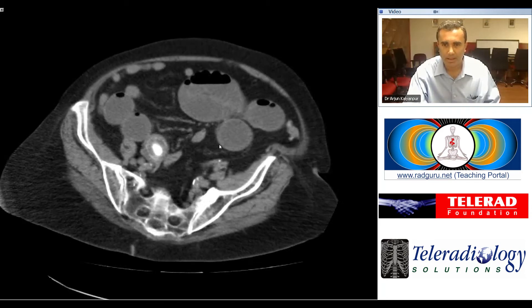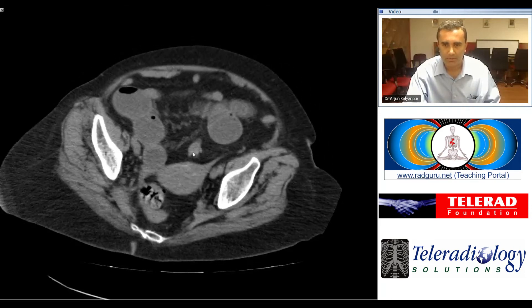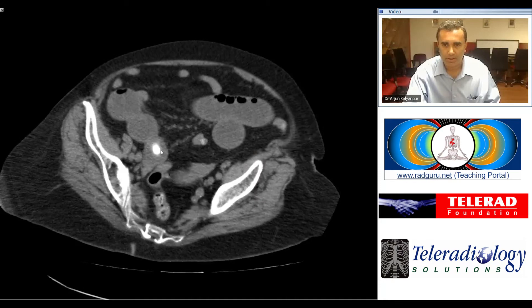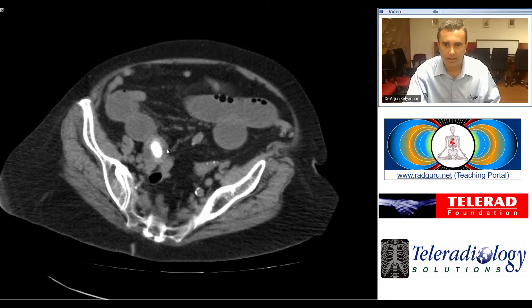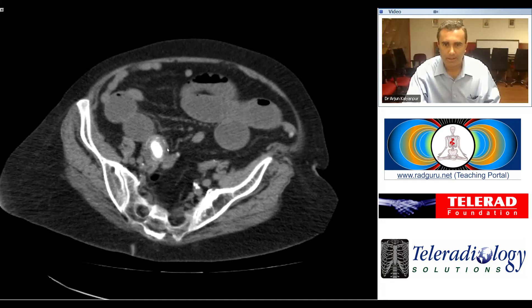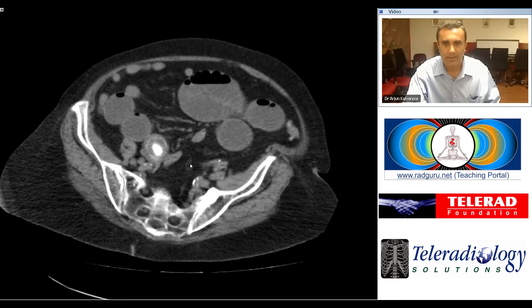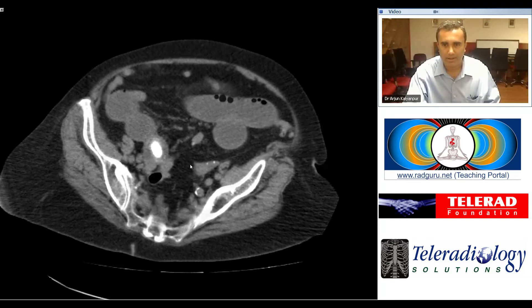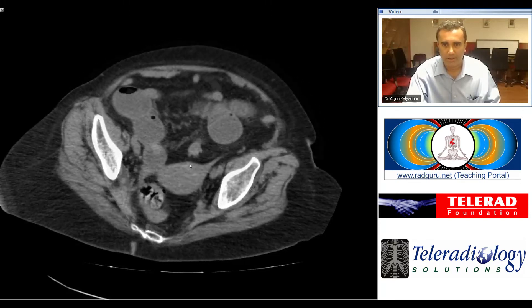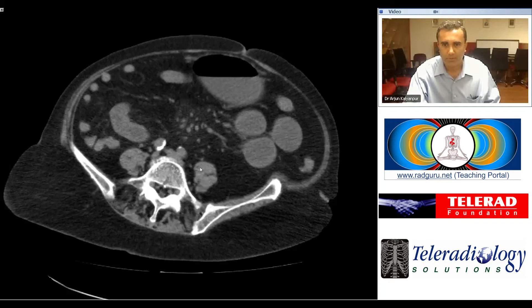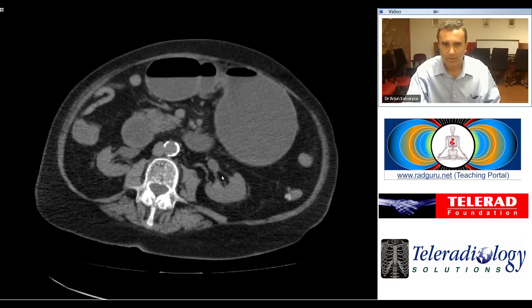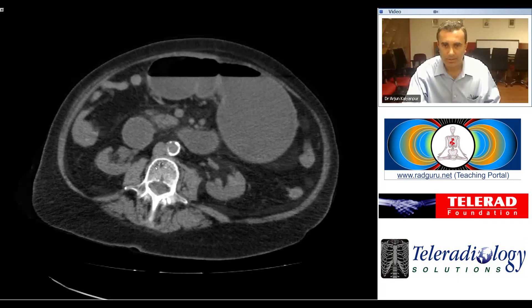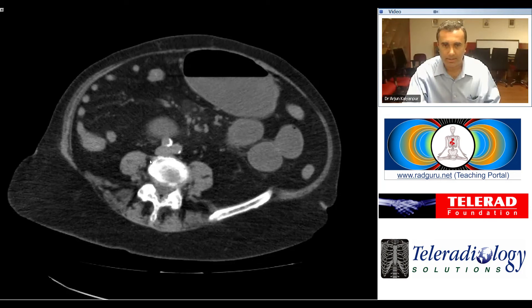As we come down into the pelvis, we see the site and cause of obstruction, which is here in the distal ileum, where there is a large rim-calcified and centrally calcified calculus which is obstructing the small bowel.